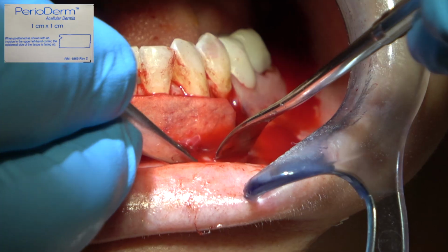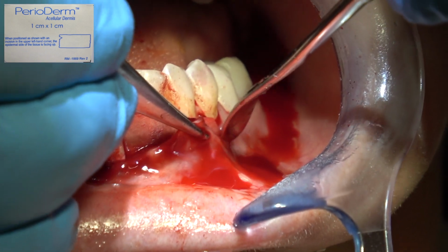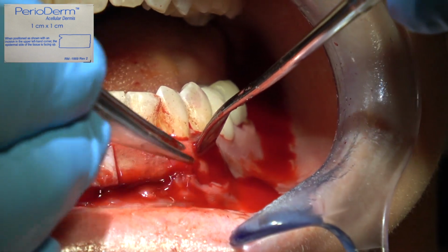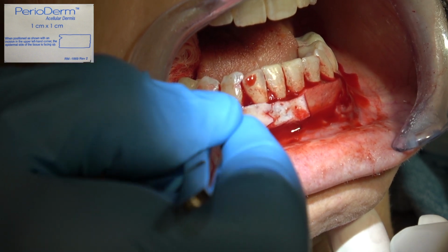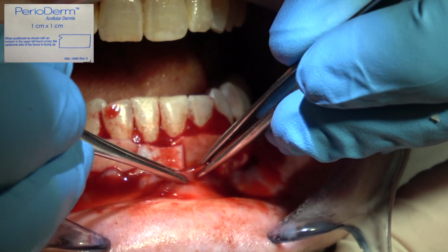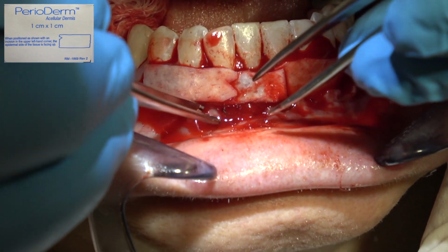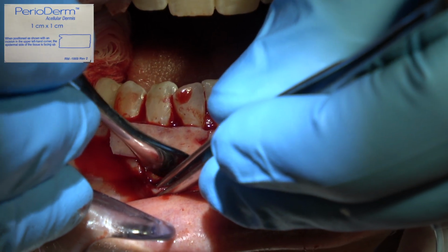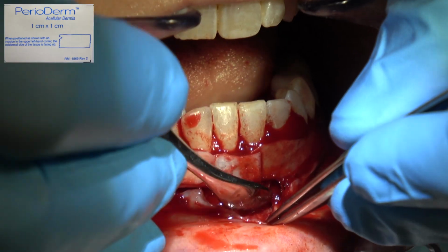So you want it down in the bottom of the flap far enough that the flap doesn't lift it up. So you have to reflect far enough that the flap will go over it easily and not be strained. I'm reflecting a little bit more.